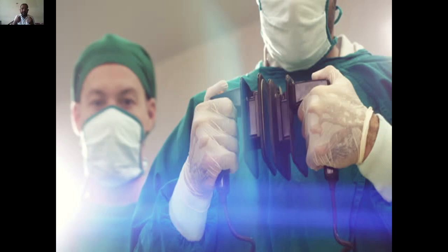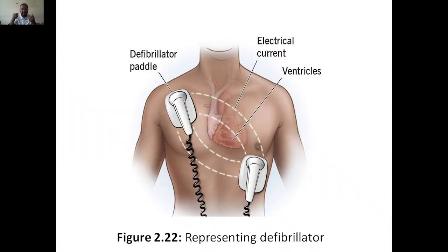You take it like this, and you give the shock like this, so that the electrical activity is delivered effectively to this part of the heart, so that the heart gets this electrical current, to the ventricles and atrium and all, and the heart will start beating normally, restoring its function.